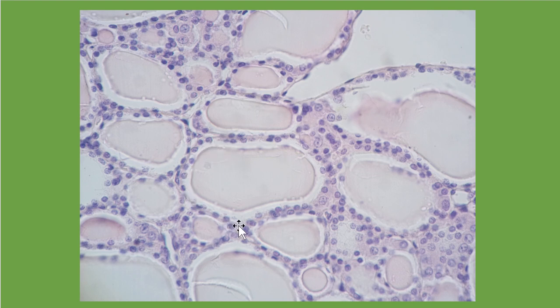So here is our follicular cells surrounding our follicle. This is the colloid here. It might help if I draw. Let's see if it's going to let me draw with my mouse. Okay, so colloid, and this whole thing is the follicle.